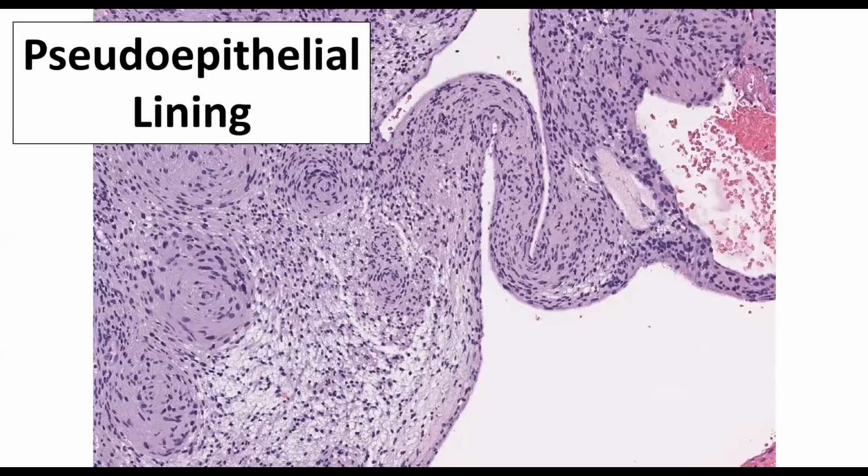It is absolutely cystic. I don't know if it's one big cyst or multiple small cysts. It's not a microcyst. It is a macrocyst that will be visible on imaging. Why? Because this is a smooth pseudoepithelial lining. You see how smooth and undulating this lining is? Along here, along here, along here. And there were multiple fragments that exhibited this smooth lining.